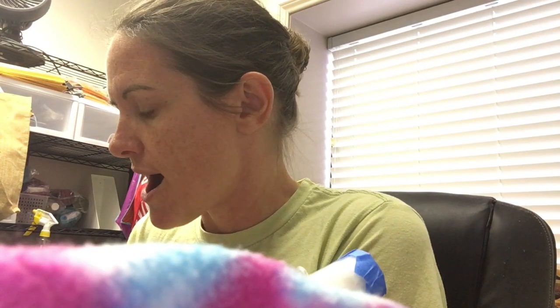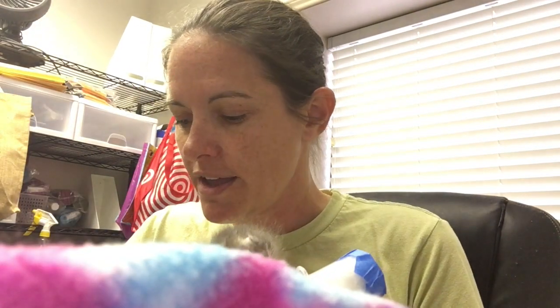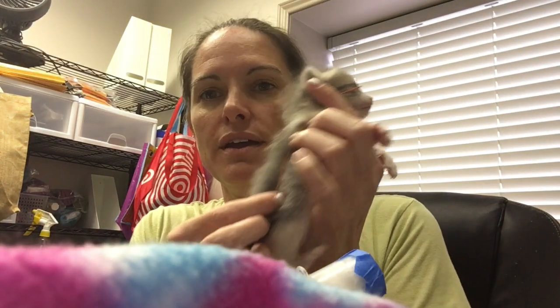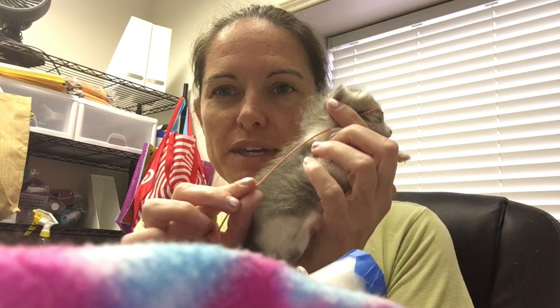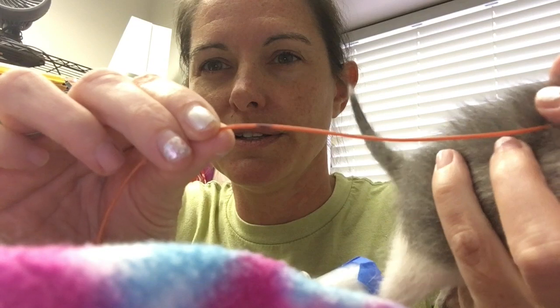So I got my tube and I got my syringe as well. And I'm also going to measure to make sure we know where the belly is on this kitten. What I'm going to do is take the tip of my tube from the tip of the nose to the bottom of the rib cage, which is right here — that's where the stomach is going to be. And this is where my Sharpie mark is going to be. I made a little spot there, so I know where to stop when I'm filling up with the milk.